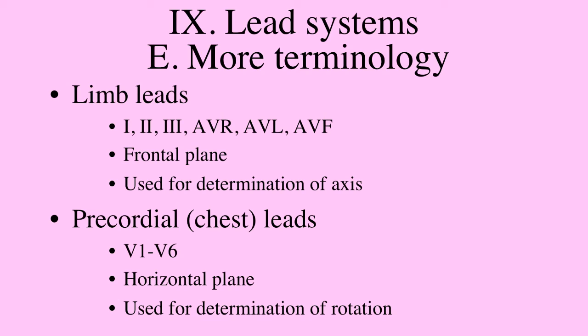So if you take that circle, you take your book and flip it and put it against your chest, that circle, and this kind of goes back to anatomy and physiology, is over the heart in the front, in the frontal plane. And so if you're lining that circle up over you, and I'm doing this right now with a book too, you put it over your chest, you should have lead 1, for example, where it's 0, on the left side of your body, like that. And then lead 1, where it goes to the other side, where it says 180, should be to the right side of your body.